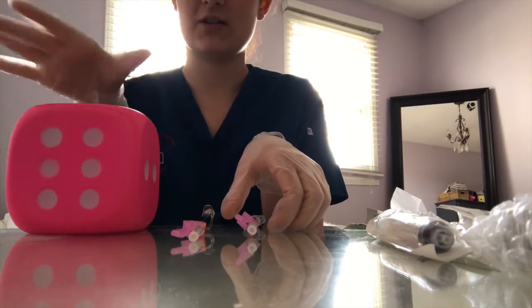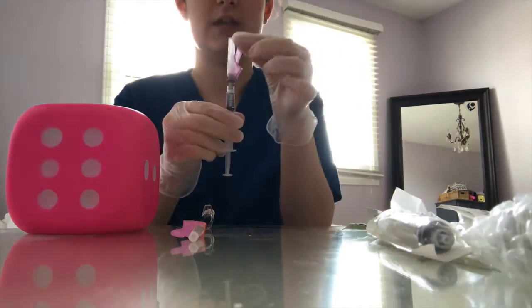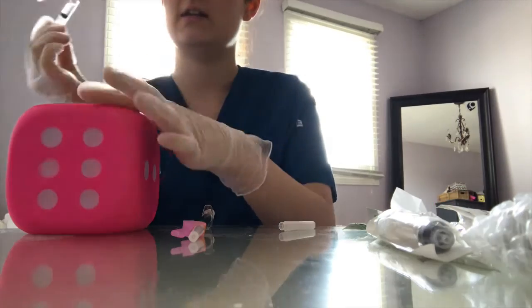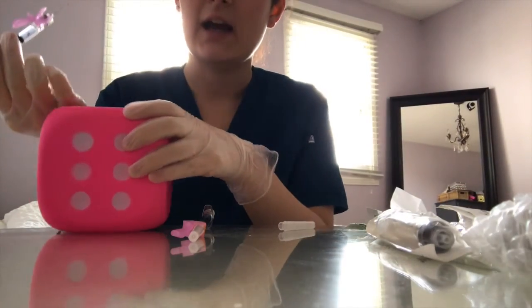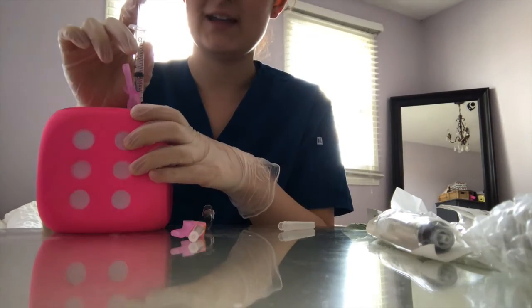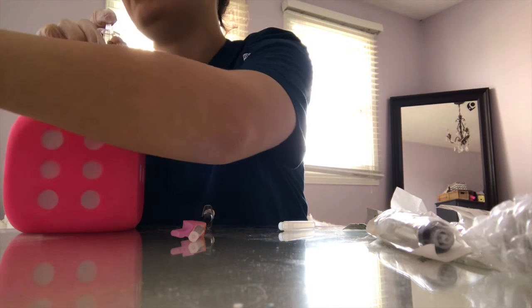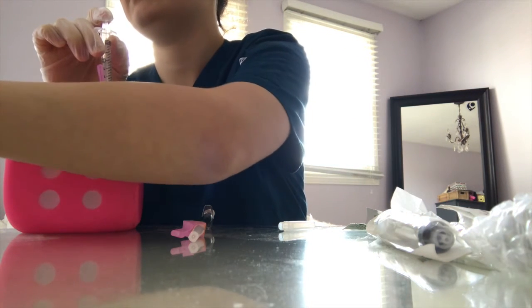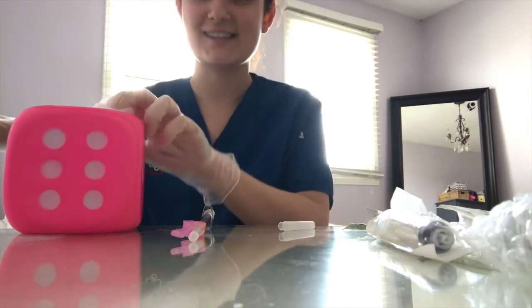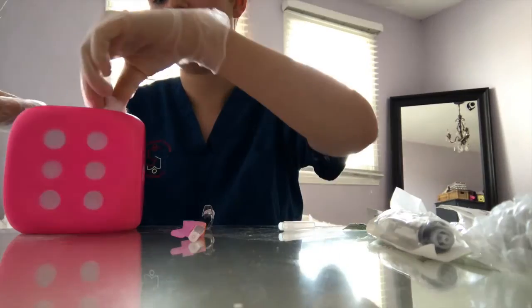Well, let's say that this is an intramuscular injection. I've landmarked, I've found my muscle, I'm ready to go. So, I have my thing. You take off the safety hub, you pull this off, you turn this around in your hand, you stabilize the patient. I hope you can see this. And then you just go in at a 90 degree, like you're shooting a dart. And you push it in. Hold. Do not move your hand like I'm doing. Okay, this swab is not wanting to come off. Okay, I wouldn't have taken that long. Remove and press. Obviously, this would happen more smoothly, but that is the dice, and it's not an actual human body.